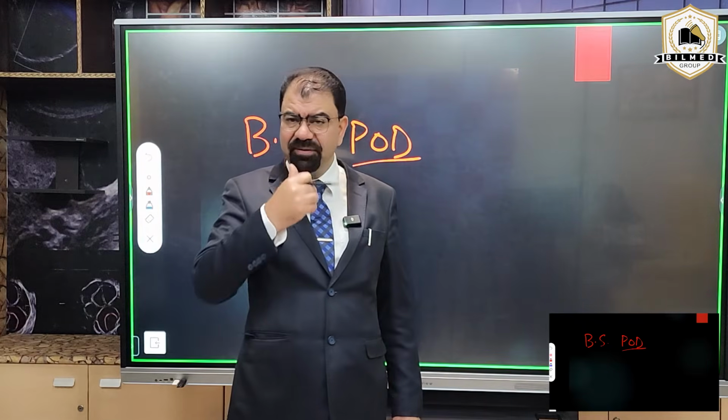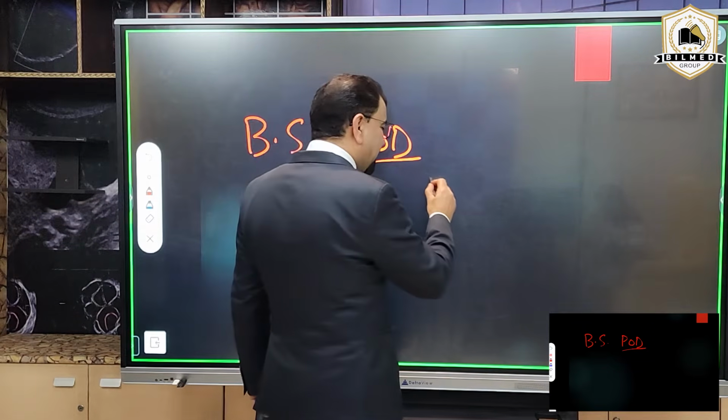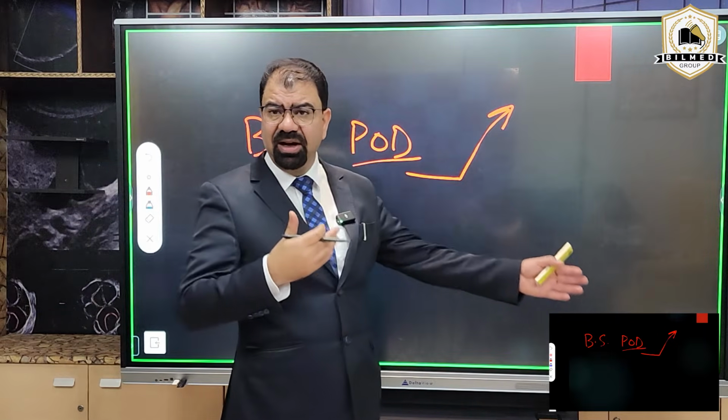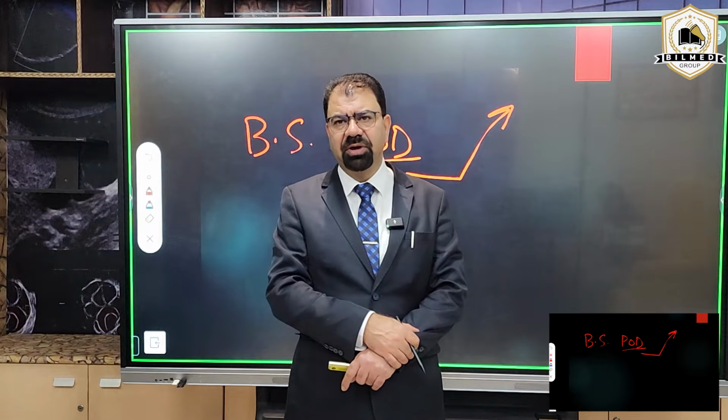And if I previously had fluid there, then fluid that is present and increasing is a marker, an indicator, of the rupture of the follicle.